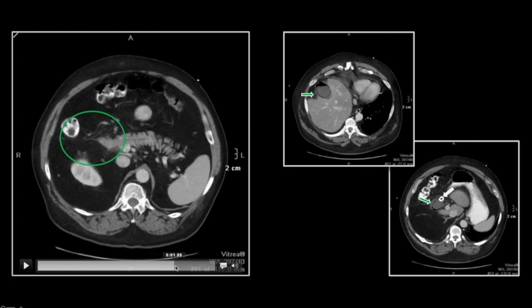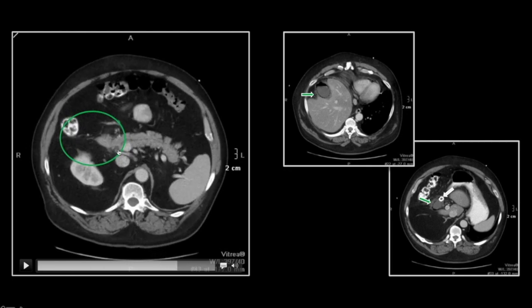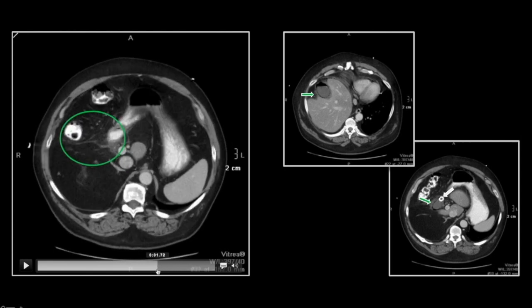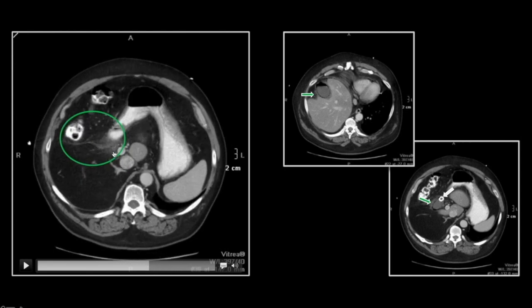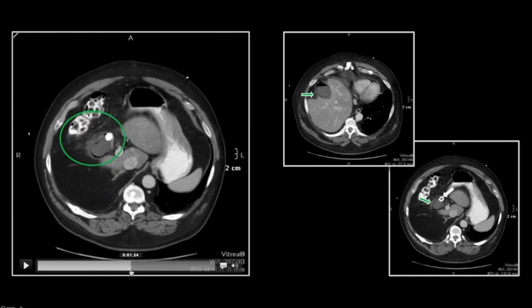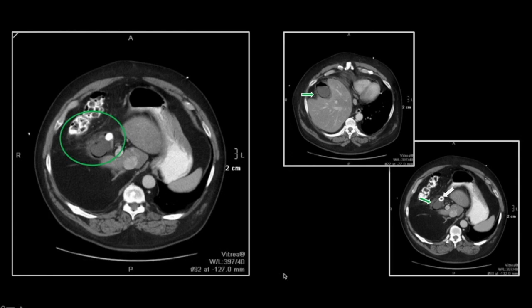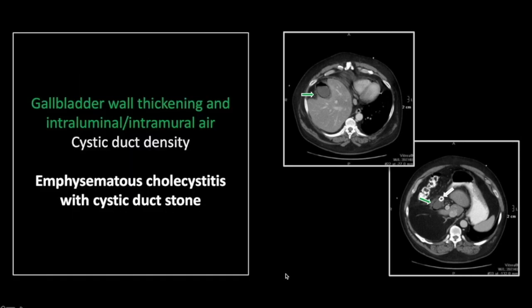You can actually pick up the common bile duct here and see the cystic duct separating from it posteriorly. There is the cystic duct, and you can then follow that up right to that stone. That is the junction of the gallbladder neck and cystic duct — a very common place for such a stone to lodge. And a classic case of emphysematous cholecystitis.